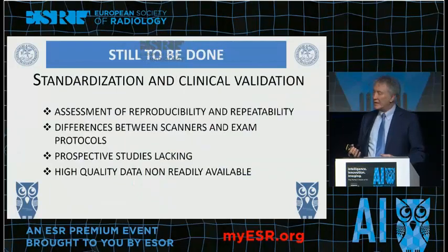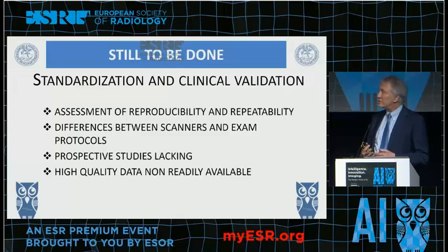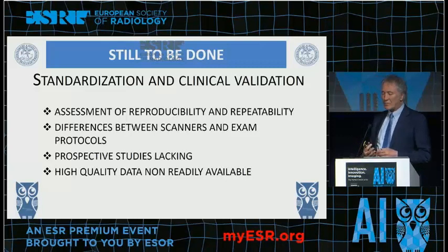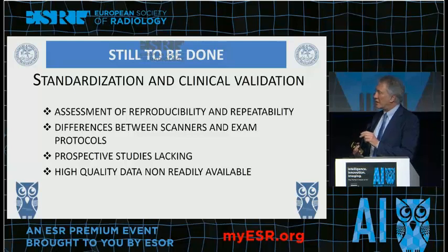The second thing that I want to stress is that we are still very far behind relative to standardization and clinical validation. And so we really need to assess reproducibility and repeatability. For example, we are noticing that when performing radiomics analysis, some features are really influenced even by small changes in the segmentation.